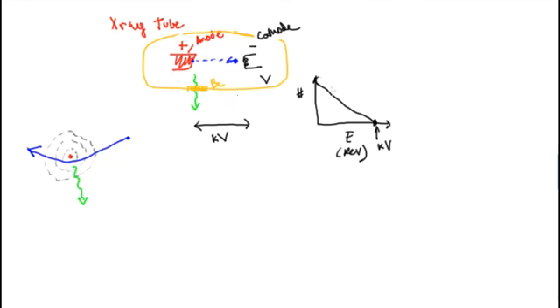When you send a spectrum through a beryllium filter, it's going to filter out some of these X-ray photons and let others through. As you'll remember from the photoelectric effect, it's more efficient at absorbing the low energy photons. So the high energy photons pass through, but the low energy photons do not so much. So the spectrum curves over like this.